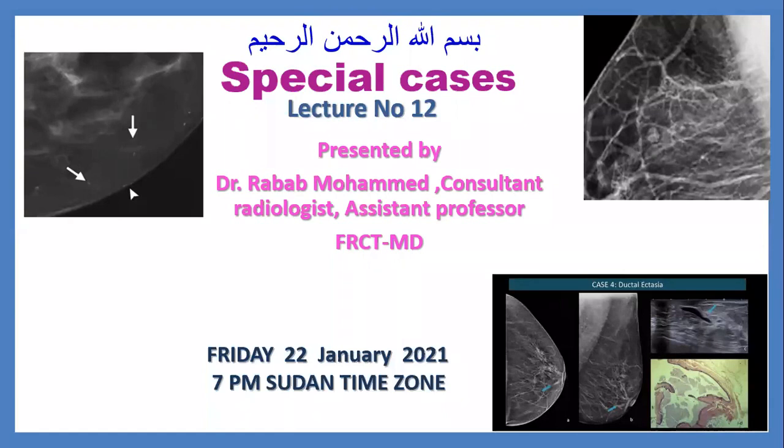I thought special cases were about the 4 major breast abnormalities that we took in the previous lectures, special pathologies. Yes. Okay. No, I'm talking about the special cases in the mammographic lexicon.